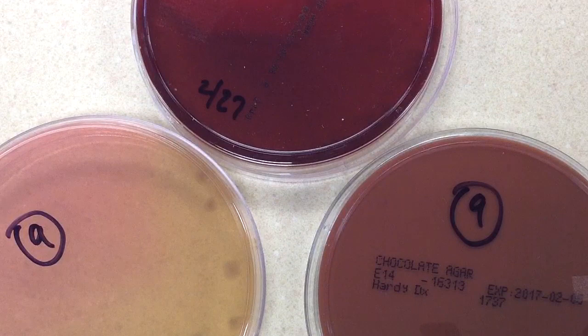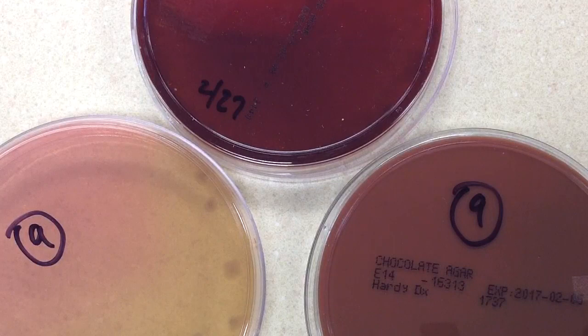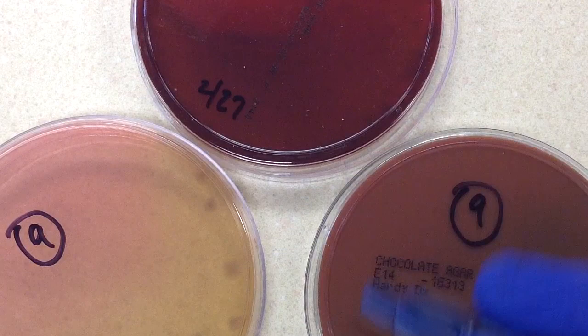It may depend on the institution, but it's probably safe to say that after you've done the gram stain of the bottle and you see gram negative rods, you are going to call the physician and let that person know. So that was yesterday — the blood culture came up positive, the gram stain was made, the physician was called, and then the culture was set up.